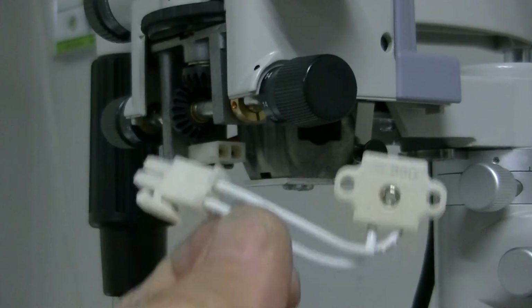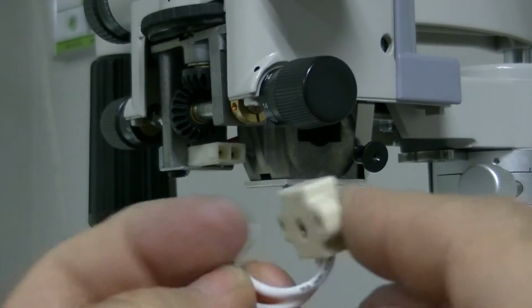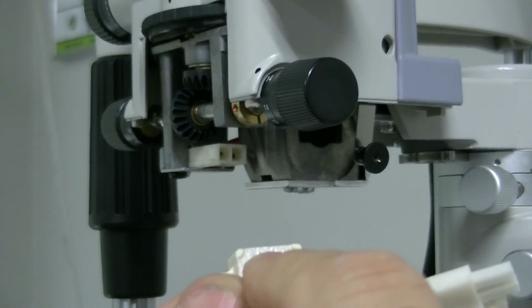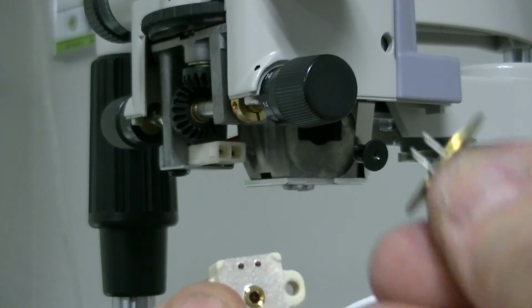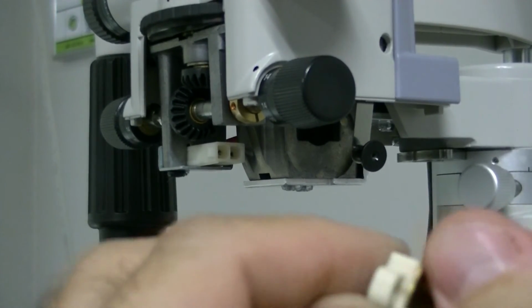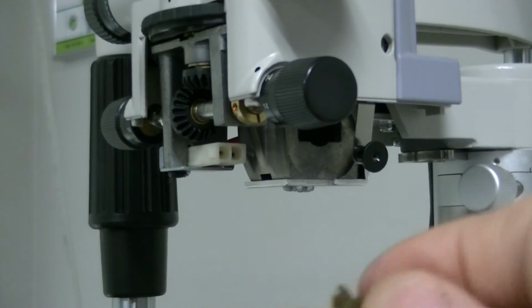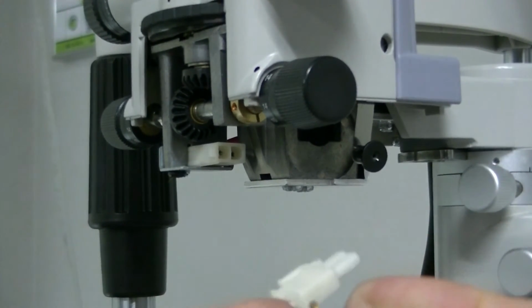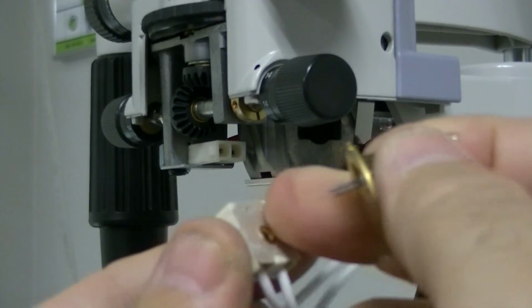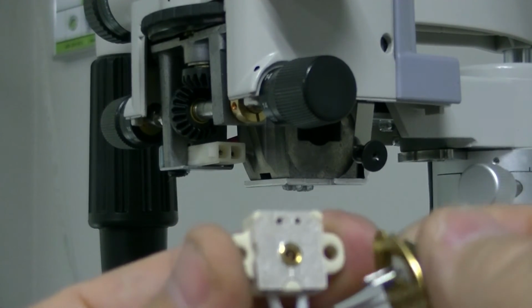There's an extra one of these in your accessory box. What happens is, over time, many years of use, these contacts and these tips right here will oxidize and they'll get weak, and they will no longer make contact with the two posts or the two prongs on the bulb. And when that happens, it doesn't matter how good the bulb is, if you have bad contacts in here, it's never going to work. It's never going to conduct the power to do it. So again, those two contacts in there is what happens when the bulb socket goes out.